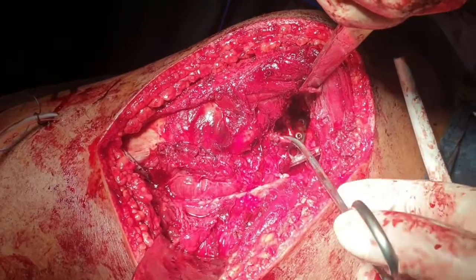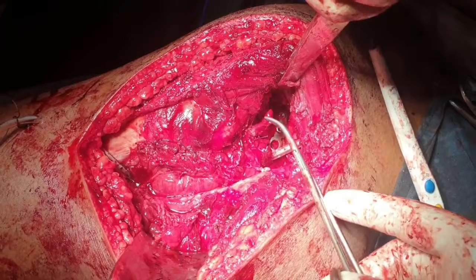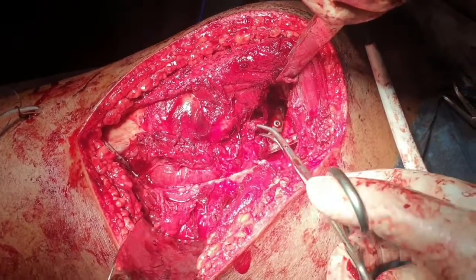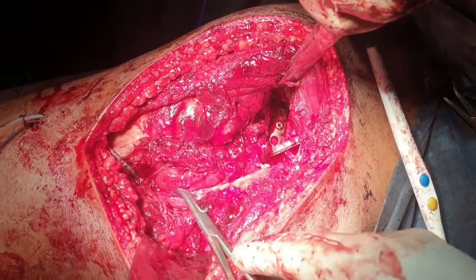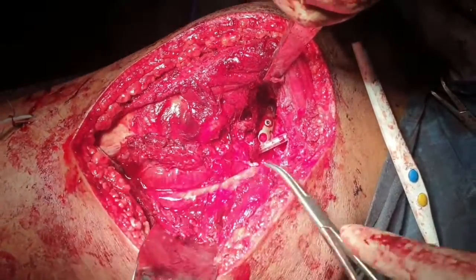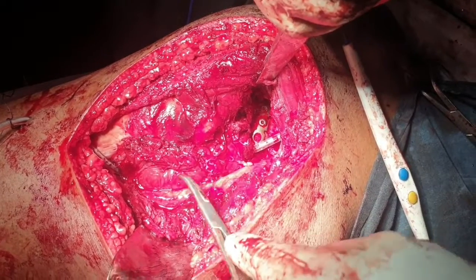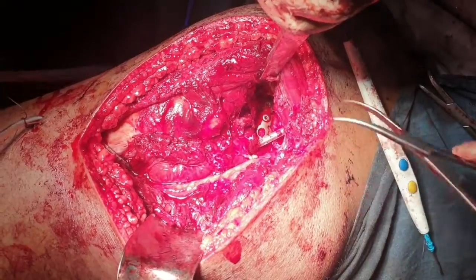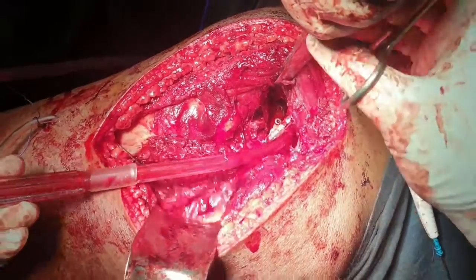But unfortunately, his piriformis muscle is too much injured and lacerated. That's why we have to excise the piriformis muscle. So we have already repaired all short rotators except the piriformis, and this is the sciatic nerve, which lies just posterior to the short rotators, and this is our plate. So we now go to close the gluteus interval.